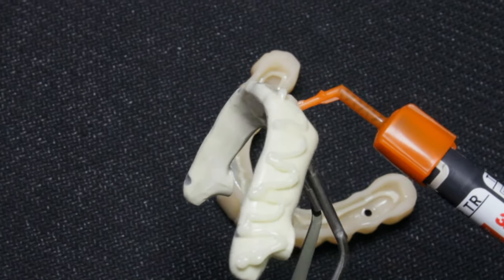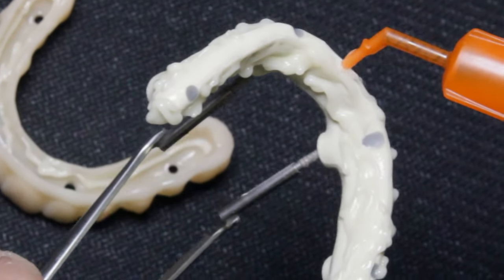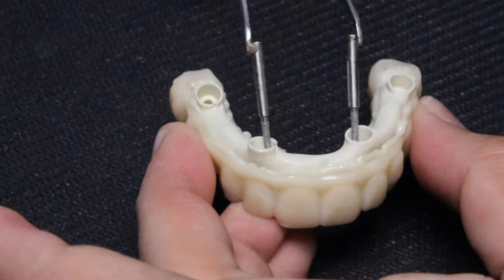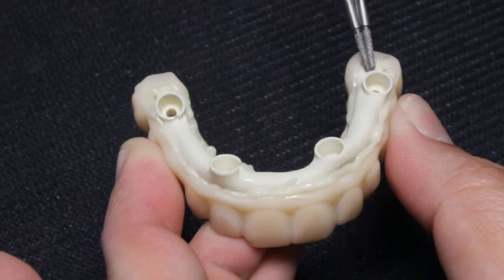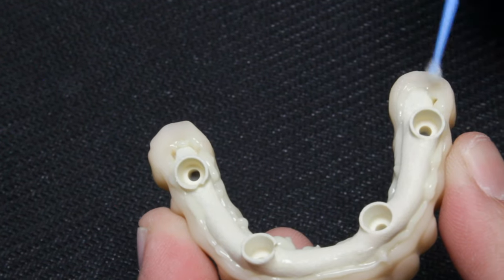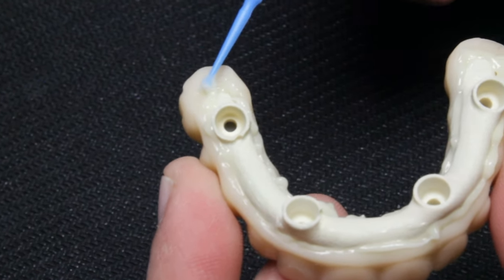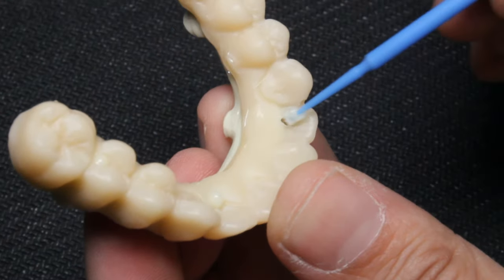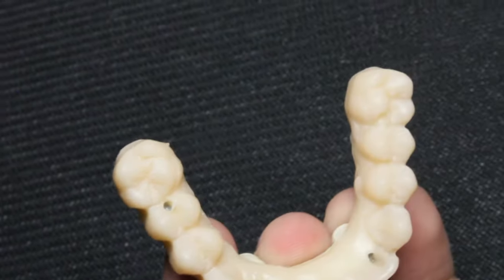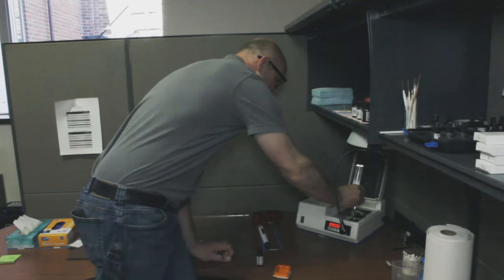I apply the resin on the interior of the jacket and the exterior of the bar, then carefully join both parts together and clean off any excess cement with a micro brush. Ideally, checking the occlusion on an articulator is recommended at this point to ensure the fusing process doesn't create any high contact points. Very important also to clean the screw access holes in the jacket with the micro brush — that is especially critical if the bar is screwed to the model. You can tech cure and then fully cure for 7 minutes in a light box.